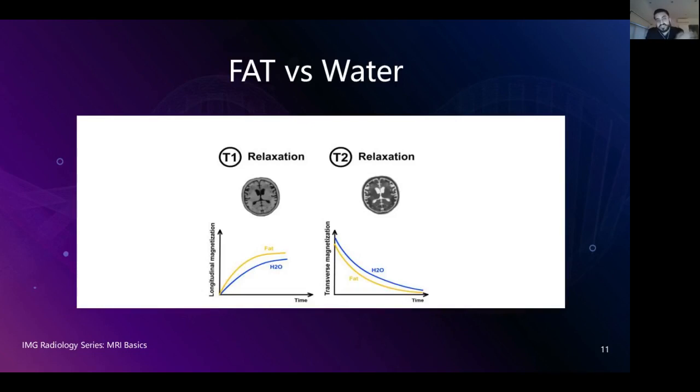The effect of this is different in both types of images. So in T1 weighted images, the fluid appears darker as compared to areas of fat, which appear brighter. But in T2 weighted images, the effect is quite the opposite. If you want to see things like cerebrospinal fluid or even sometimes acute bleeding or strokes, so you're looking at blood, for example, T2 weighted images would show the fluid or water being brighter than the surrounding fat, which is in the cerebrum or the brain tissue.